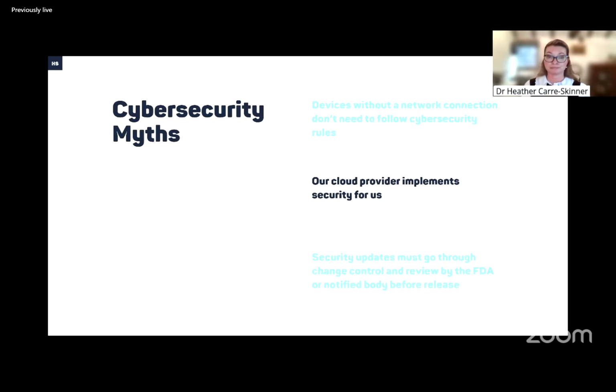Yeah, absolutely. So if you're doing SaMD, it's all based in the cloud, perhaps you're analyzing images. One common one I've come across is that our cloud provider implements security. Now, cloud providers have what's called a shared security model, where they document what they are responsible for security-wise.